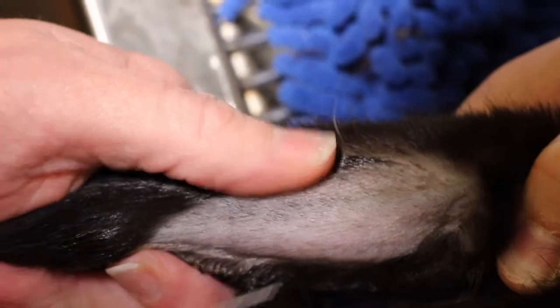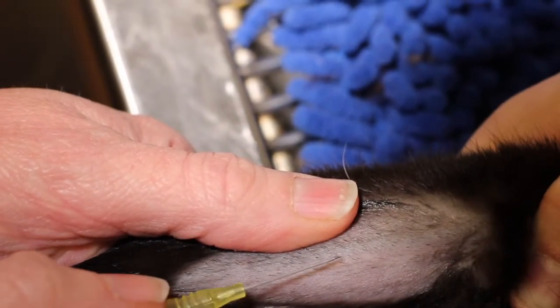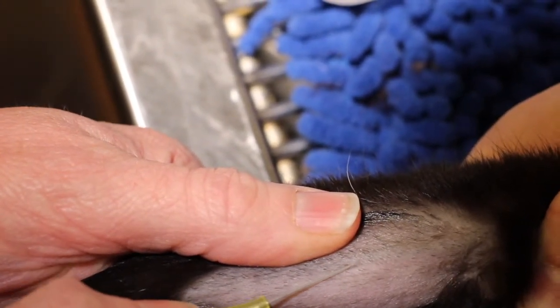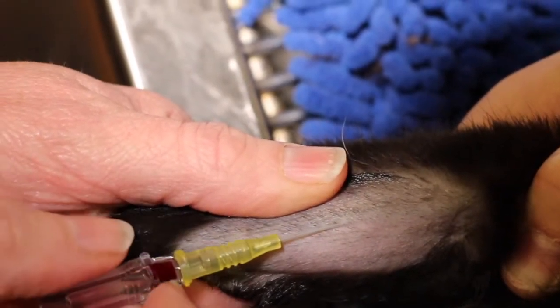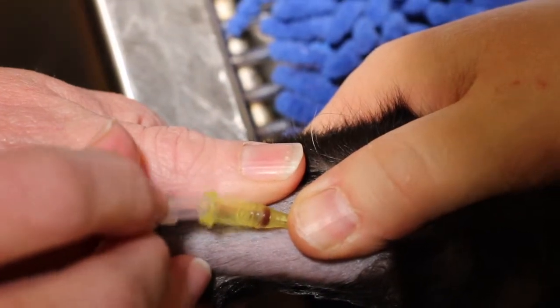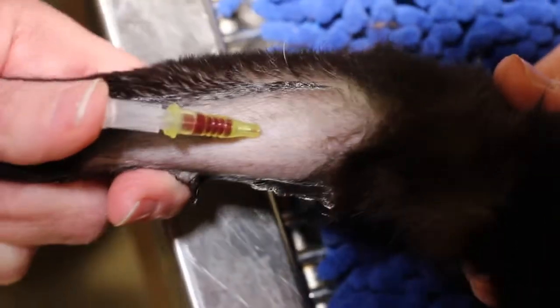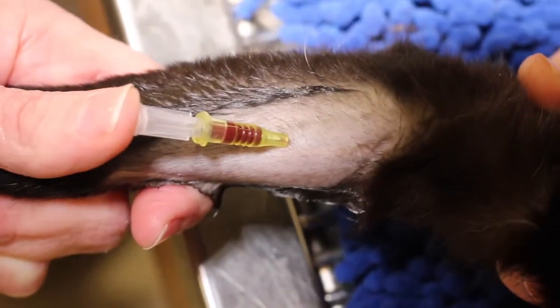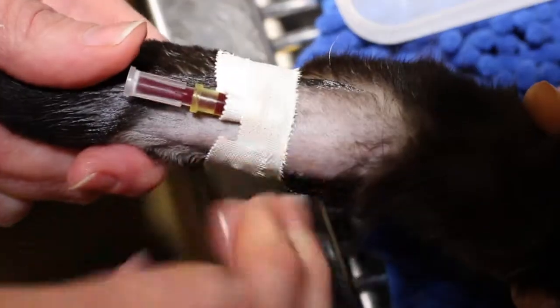You see it right there — it's a little bit darker than the rest of the skin around it. I always put my non-dominant thumb up against that vein, then I come in from the opposite side with my needle. So if it rolls, I trap it into the skin. I have a flash in my hub. I'm going to advance just a little bit more, then press my catheter off my needle. I'm going to put a temporary cap in so we don't get blood everywhere. I'm pushing that catheter in with my thumb while I hold the paw with the rest of my hand. I take half a piece of tape, slide it under the catheter sticky side up, then double it over on itself and tape it around the arm — that's going to hold that catheter in place.